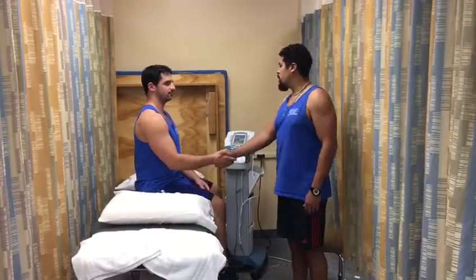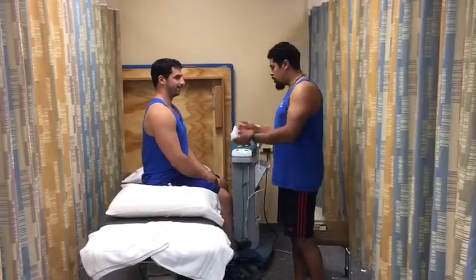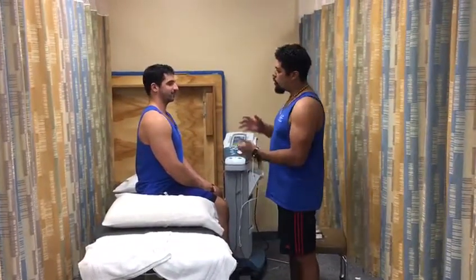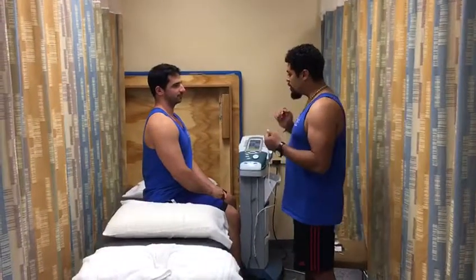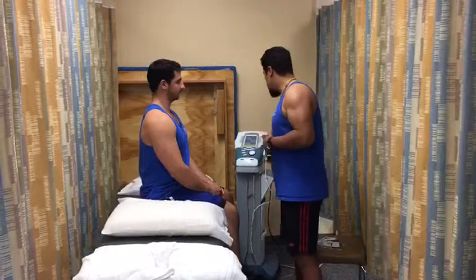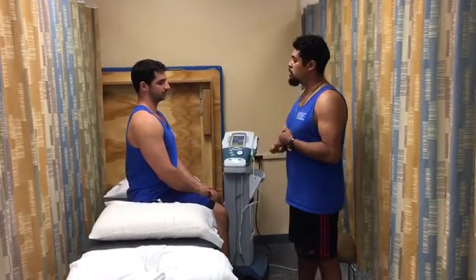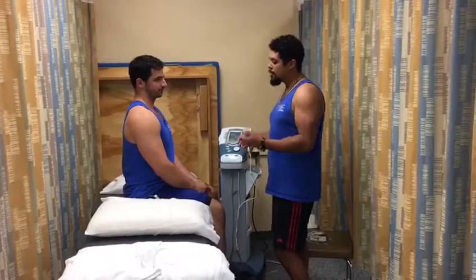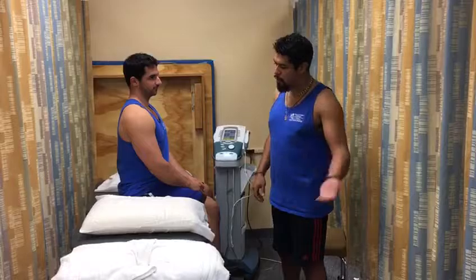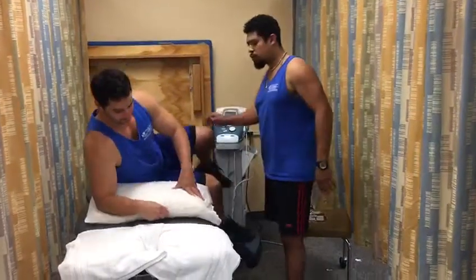Hi, Daniel. My name is Rafael. I'm going to be your physical therapist assistant student today. I saw on your chart that you have an acute lumbar strain. We're going to be using electrical stimulation to reduce some of that pain, increase some circulation to promote that healing process, and to increase muscle performance so that later on you could do some exercise. So if I could have your head this way, feet this way, facing down.